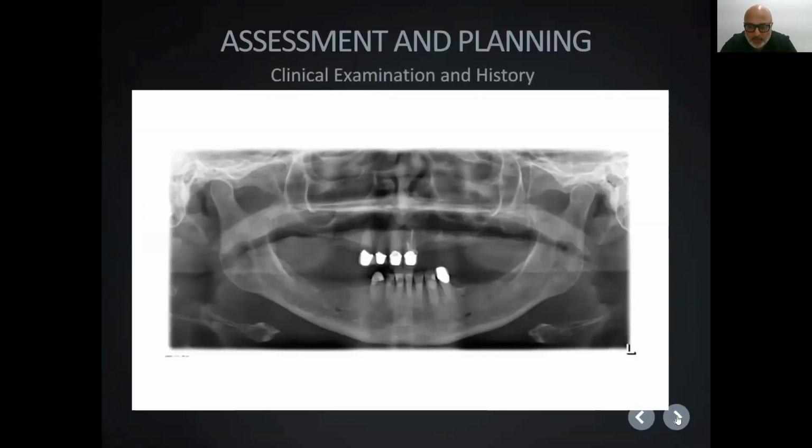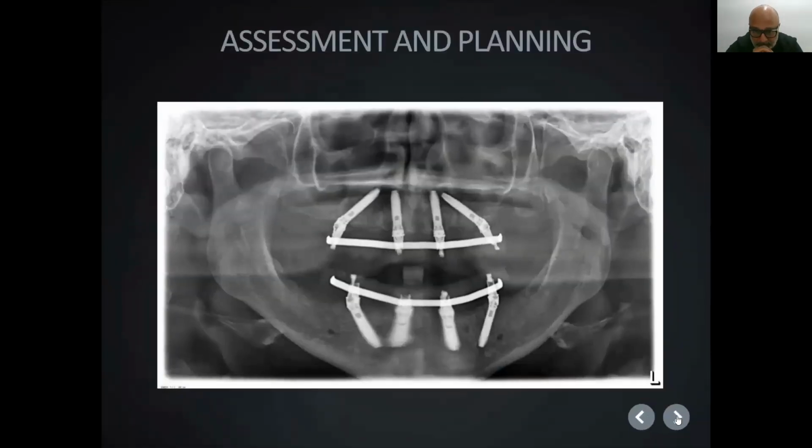Okay, so going back to what we had, we decided that we'd treat this in a full mouth rehabilitation way, popularly known as all-on-four, or whatever you like to call it. Pretty much the same strategy. So we decided that with the amount of space and bone that this patient had, we would place 4 upper implants and 4 lower, the 2 distal in each arch being angled, and the 2 in the center being straight for distribution of anterior-posterior forces.